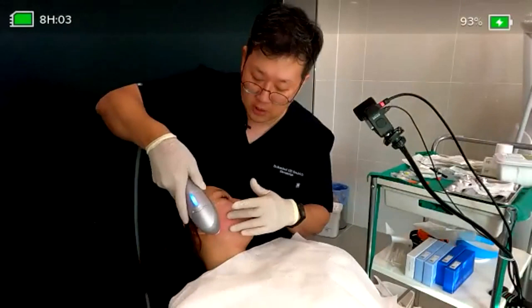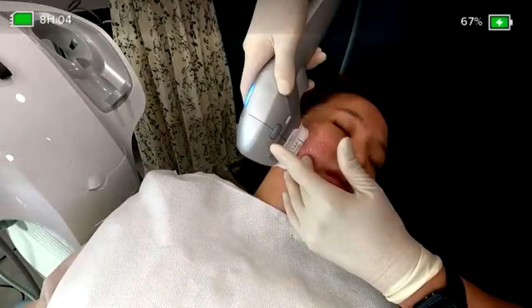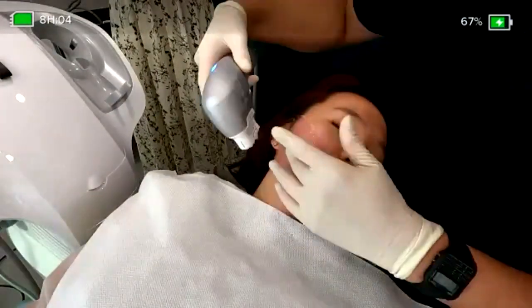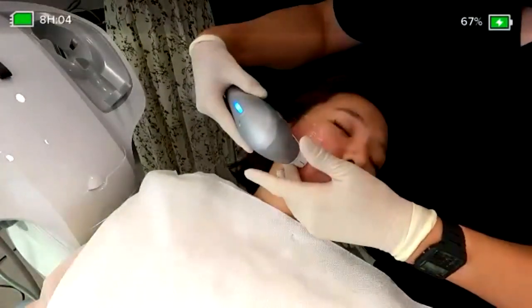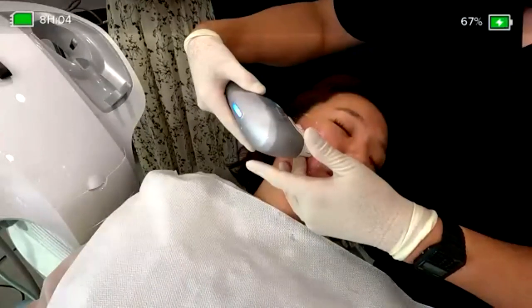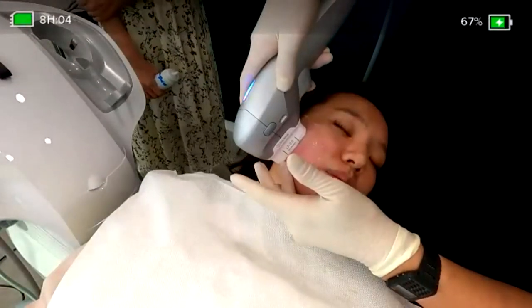This can be important when you make a lattice treatment, because when we are focusing on our treatment, sometimes we are doing over treatment. Under treatment is always quite okay because if she's not satisfied, we can do more. But over treatment, we cannot overcome. Okay, 2 passes for the contour lines.